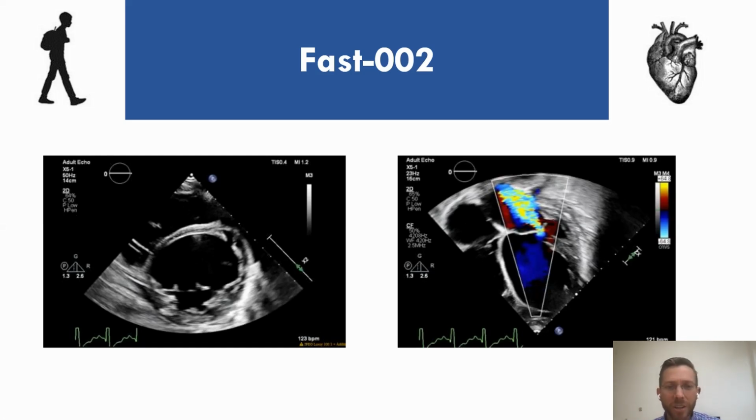And then the more circular structure that's sitting in the middle of the image is going to be his left ventricle. And what we can see here is the walls of his ventricle are thin, much thinner than what we'd expect. Also, the image on the right is indicating his blood flow, from which we were able to determine his ejection fraction, which, as noted previously, was severely reduced.